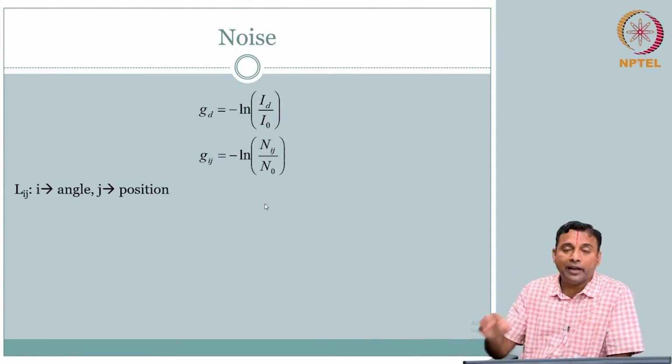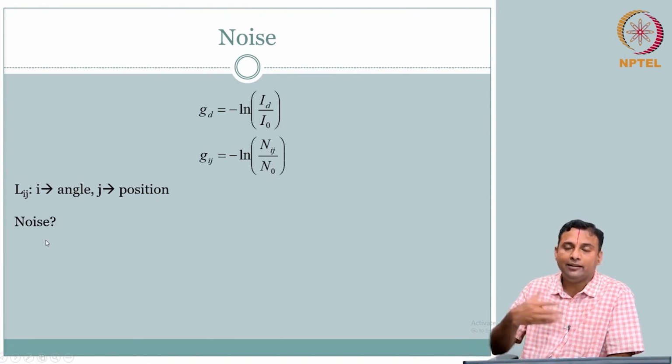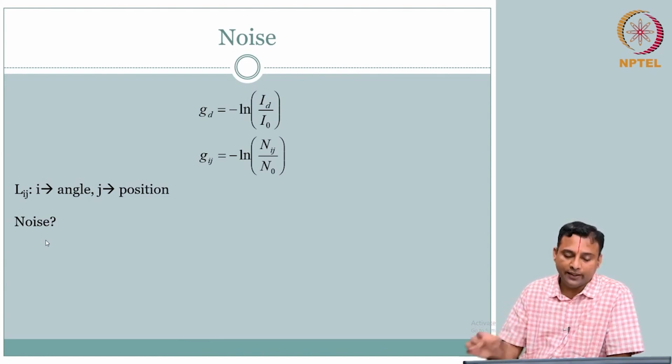The burst time of arrival could be statistical, and therefore we also said one of the random statistics that is useful to characterize this is your Poisson. So your randomness comes in your Nij, right? When we say randomness, there is a statistics, mean and variance. Variance, or the fluctuation, is your noise, right? So where is the noise coming from? Noise is because of this guy, Nij, the number of photons that are hitting the detector.